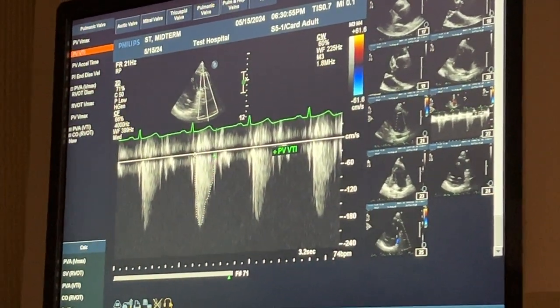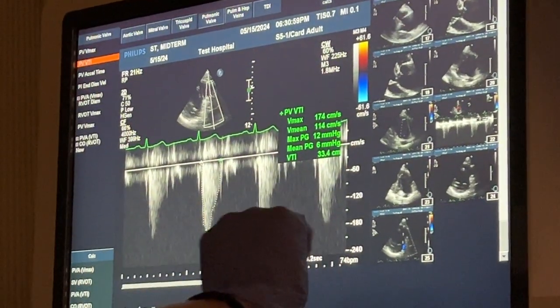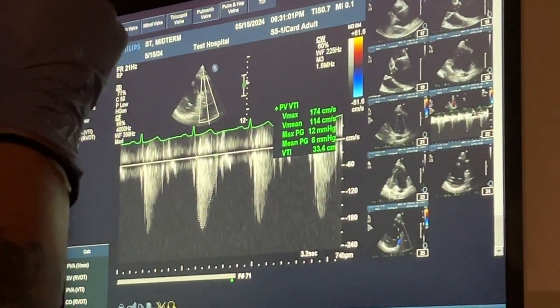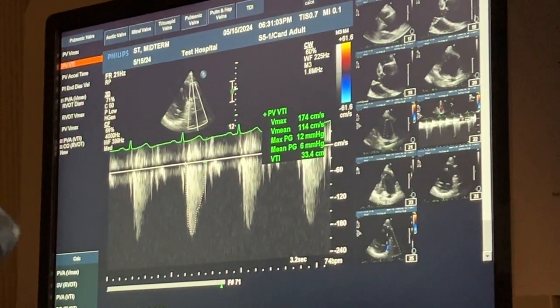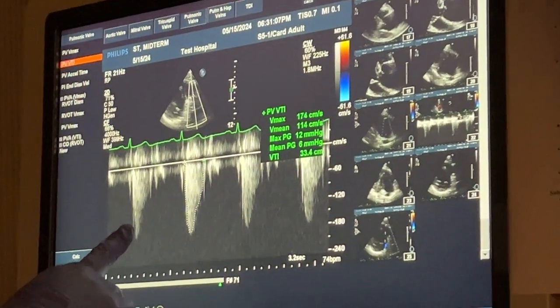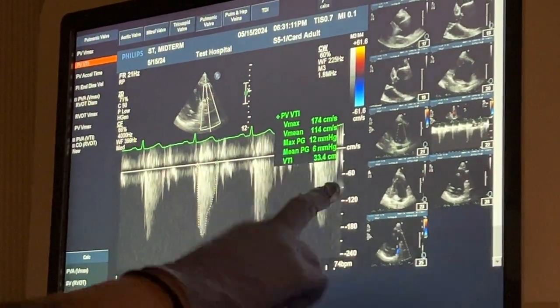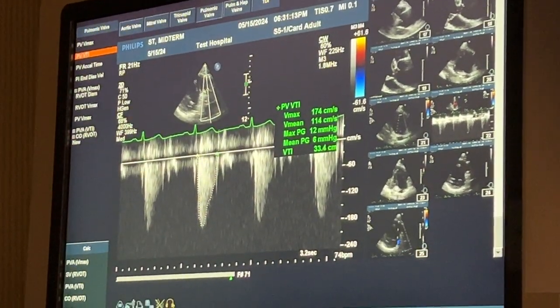You measure all the way up to that valve click, because that click right there, click, click, click, that's showing where the valve closes. Measure between clicks, exactly. So remember how we were saying with valve prostheses, valve opening and closing clicks are more prominent? That is true, and it's helpful.